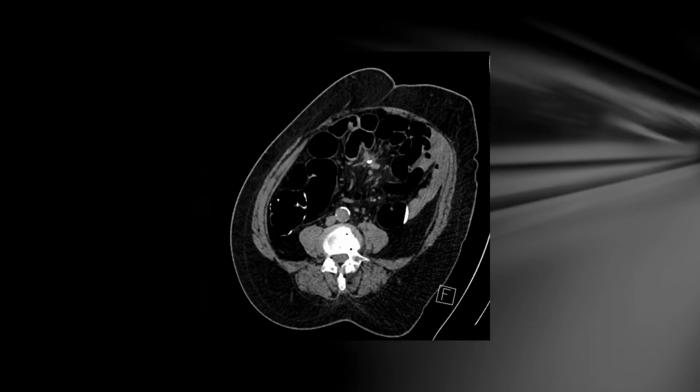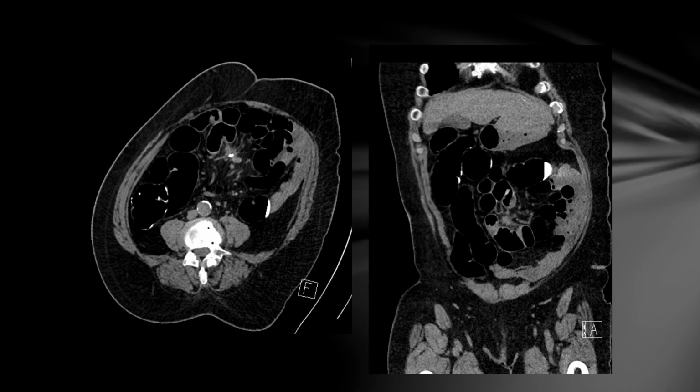For example, this patient presented for a CT colonography study because they had a change in bowel habit, which is why the colon here is all distended with gas, and so is some of the small bowel. That study didn't show any abnormality in the colon, but did show this within the mesentery. The mesentery is just the fatty area between the small bowel loops, and that's showing this soft tissue mass here, which has a bumpy, irregular margin and some calcification within it. And that's a really typical appearance for a mesenteric metastasis from a neuroendocrine small bowel tumour.